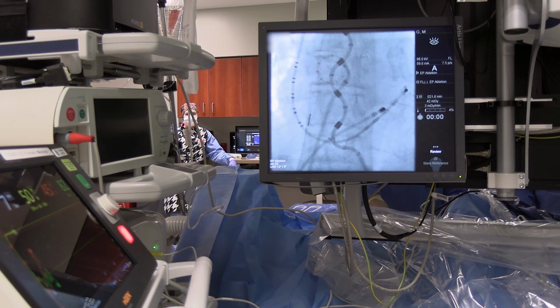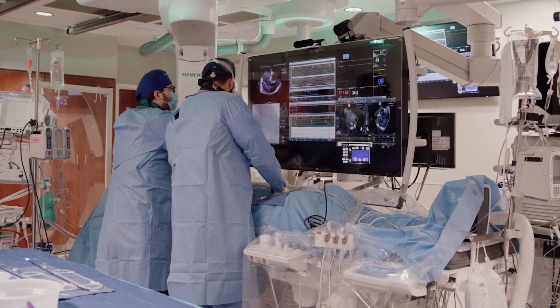It's nice to not be tethered to the X-ray, not to be forced to use the weight of the lead, not to expose all of the staff in the lab. I mean, the patient as well, but the patient's only getting one procedure. The staff is getting bathed with scatter radiation day after day after day. And those are not trivial risks to the staff.